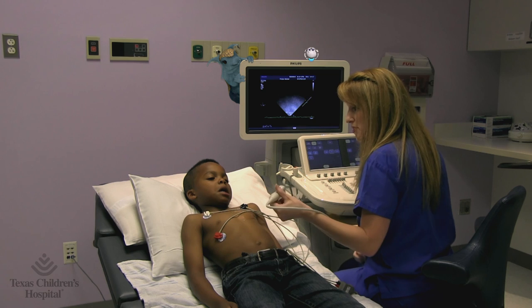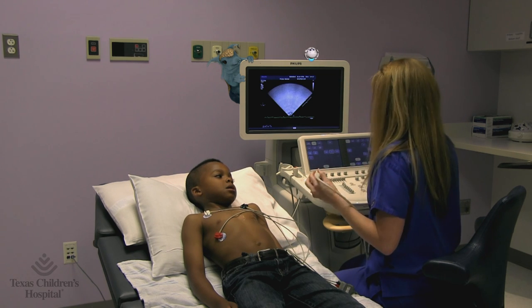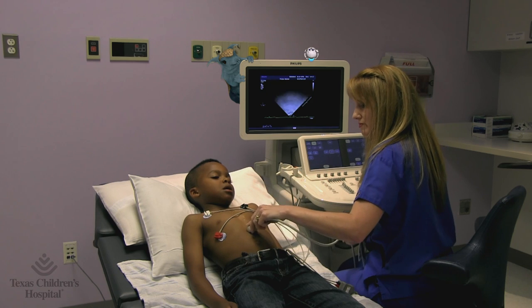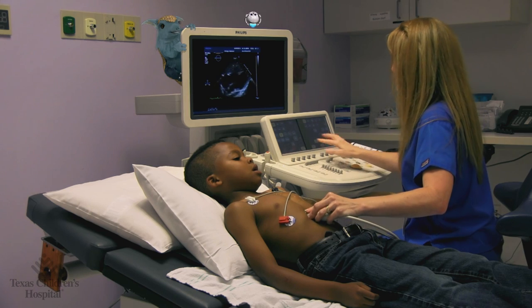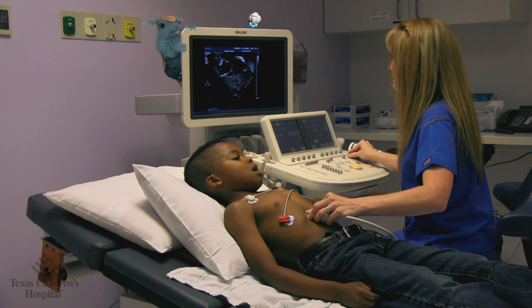Now we're going to take some from your tummy from underneath. Now they're looking at the vessels that carry blood to your heart, and then away from your heart.